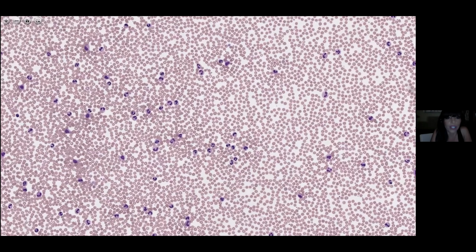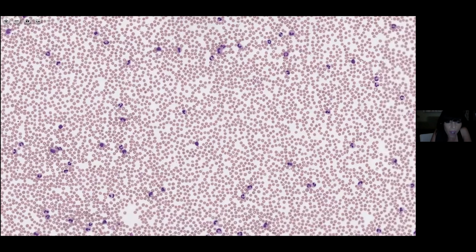Okay. We go through the slide. So again, we want to know what's causing our patient's leukocytosis. So we can look at low power. And again, we see a lot of neutrophils here, but they are not in various stages of maturation. They're almost all exclusively mature neutrophils, either in the segmented stage or bands. But there are not a lot of immature cells here. All of these neutrophils look like pretty much segmented or band forms, maybe some myelocytes.